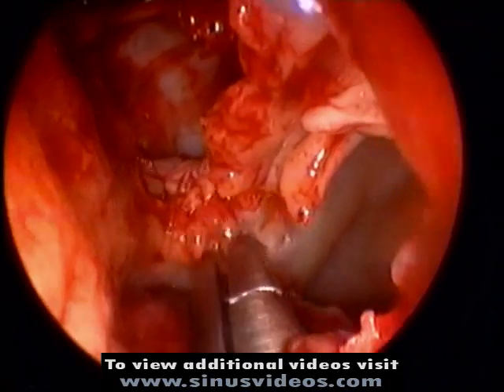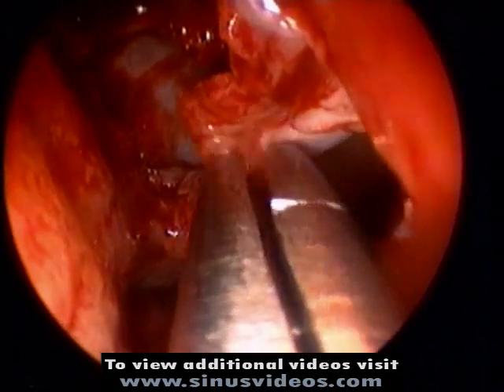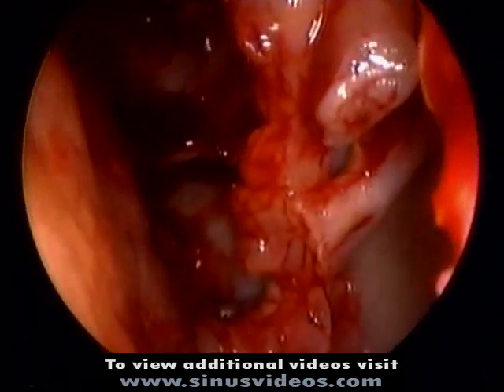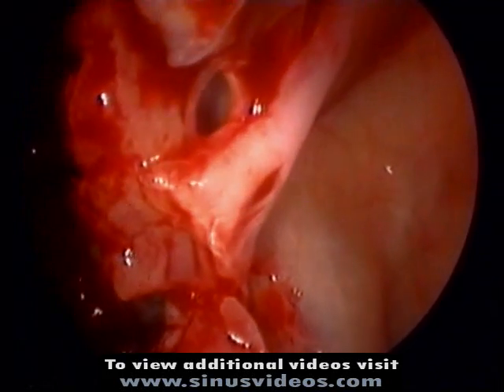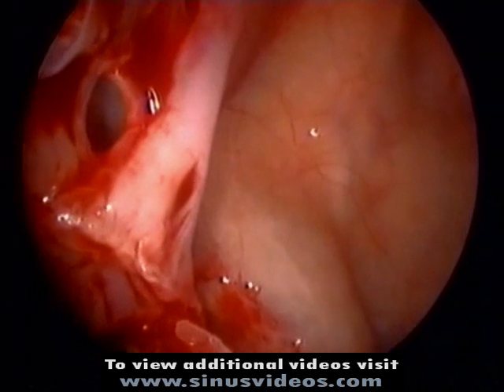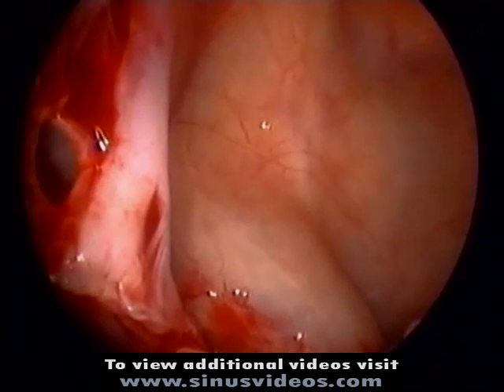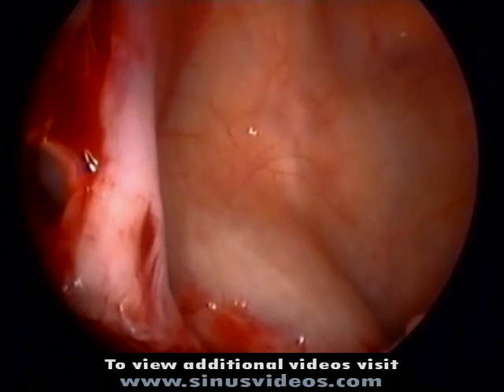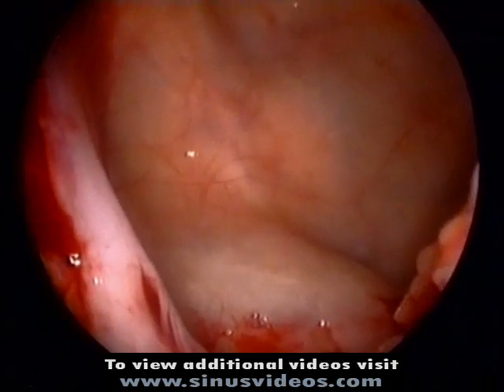If we change from a 0 degree to a 30 degree nasal endoscope, the sinus interior with the infraorbital nerve running along the roof of the sinus can be well visualized here.